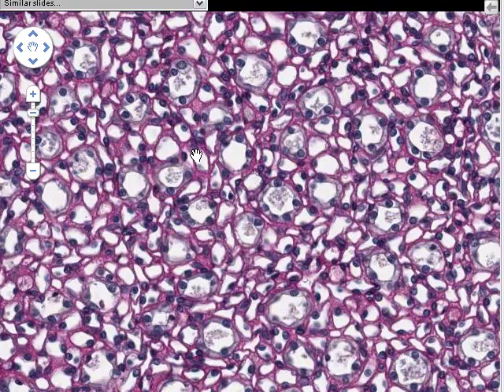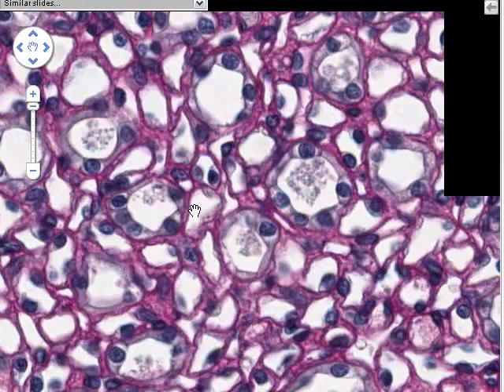Let's go into even higher magnification, and here is what it is that we're going to look at. The first thing that you'll note is that there's some intense red staining, and here the basement membrane has been stained because of the stain that's used to stain the tissue. So the intense red staining lines which you see are where the basement membrane is. You'll see a lot of spaces or gaps, and these are the lumens of the various tubes which are present here. The tubes which are present are tubes which are either carrying urine or indeed some blood vessels, although we won't pay too much attention necessarily to the blood vessels. So let's zoom in to the highest magnification.